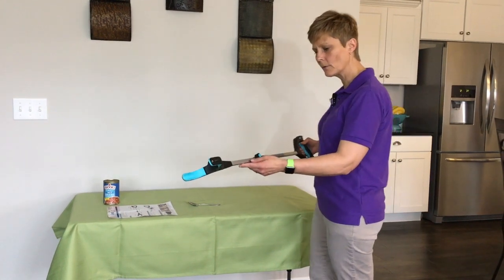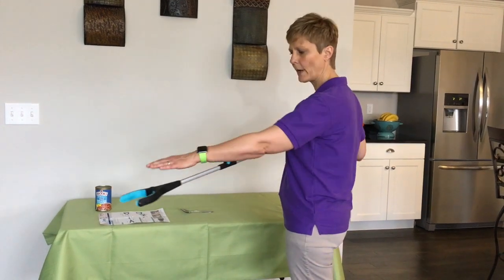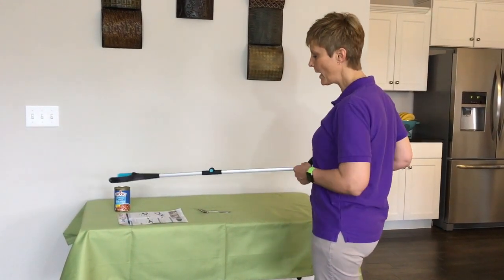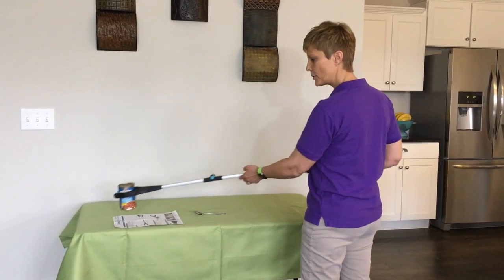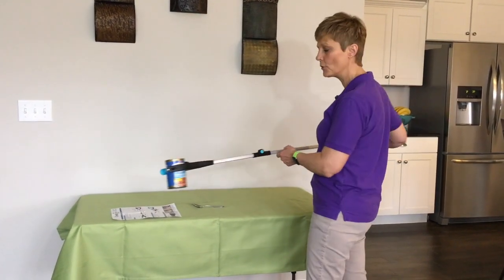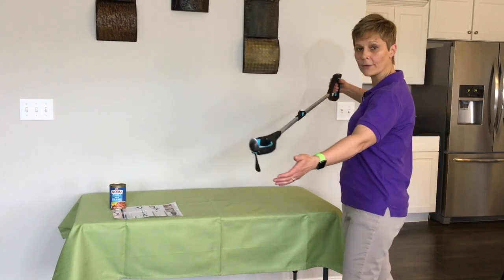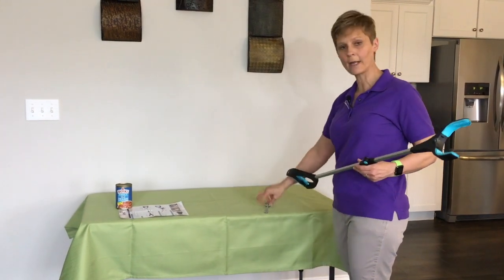This grabber's full length is about 40 inches, and from where your hand is to where it's grabbing things is about 34 to 35 inches, so it's a pretty nice length. The only thing is when you grab something, it's a little long to actually pull that to you and take a hold of it. So you're going to have to just grab something, bring it to a surface that's close to you, and set it down so that you can get a hold of it — like picking up this spoon and bringing it closer to me.